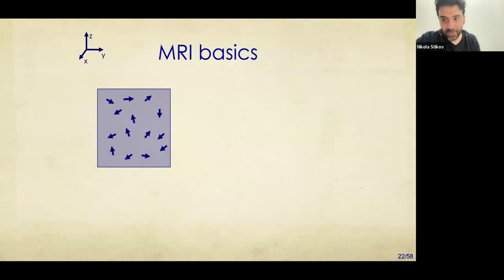It's very wrong to think of it that way. In reality, magnetic spin is a quantum mechanical phenomenon, and these magnets are never oriented diagonally. They're always oriented parallel to the field. Except, as engineers, we try to simplify things.